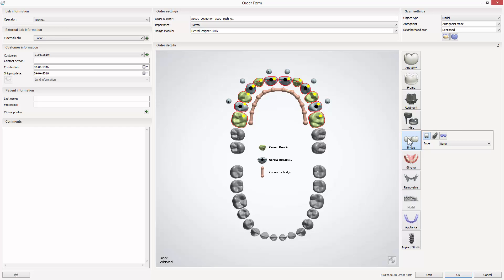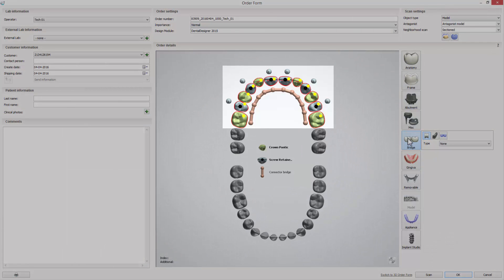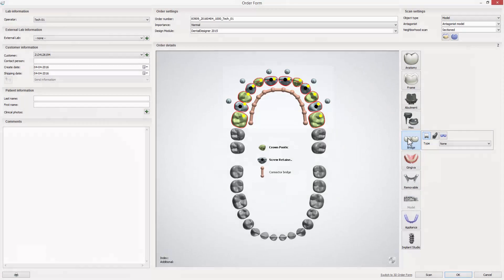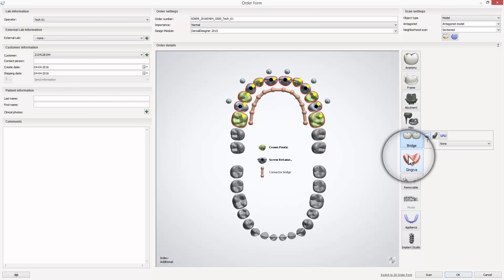Once all teeth have been bridged, the abutments and screw retained crowns will be grouped automatically for one insertion direction. The last step of order creation is to add gingiva.